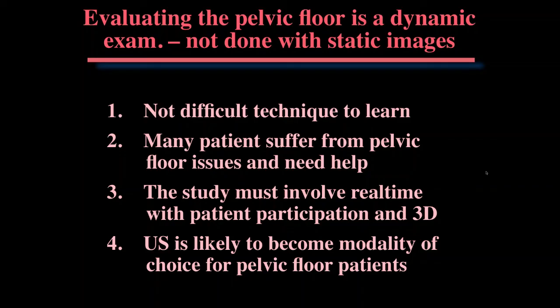This is a fairly new field. A lot of this is coming out of Australia, and it's really not something that's used very much in America. So we're really starting to evaluate what we can and can't do with it, and I'm sure that we can do a whole lot more with it than what I've shown you tonight.